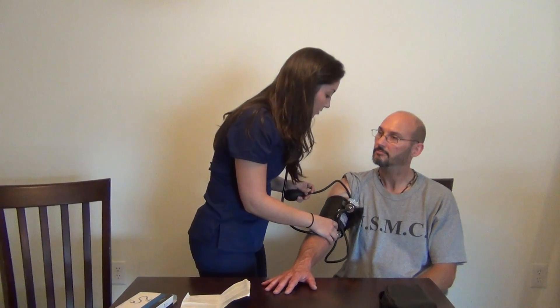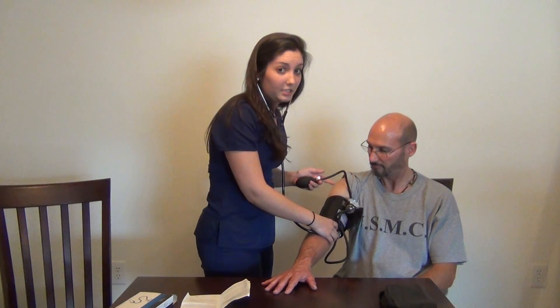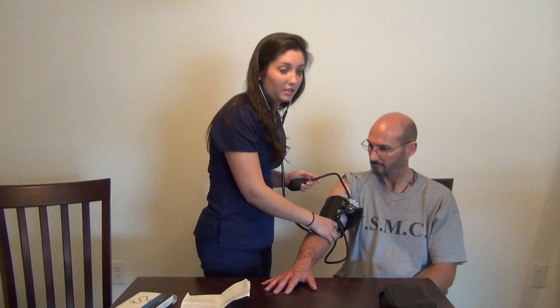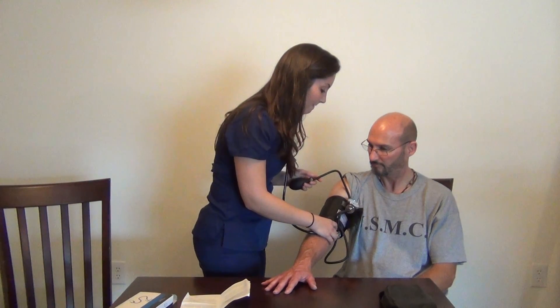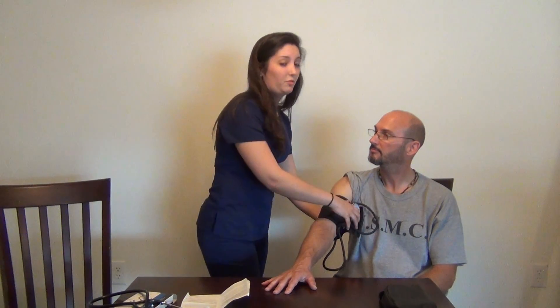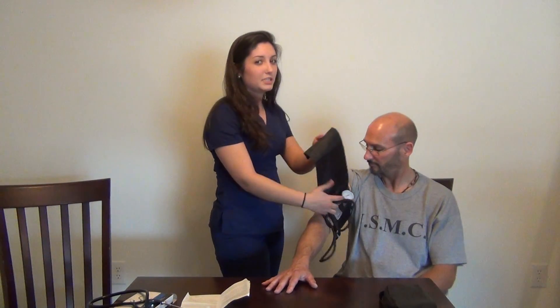The very last pulse beat you hear — you'll hear a series of pulses — the very first is the systolic number, and the very last is going to be the bottom number, the diastolic blood pressure reading. After that last one, you should not hear anything. Then you can deflate the cuff all the way and quickly record your blood pressure. If you didn't get it, don't worry — it takes a lot of hard work and practice to hear precisely what you need to hear and release the valve at just the right speed.